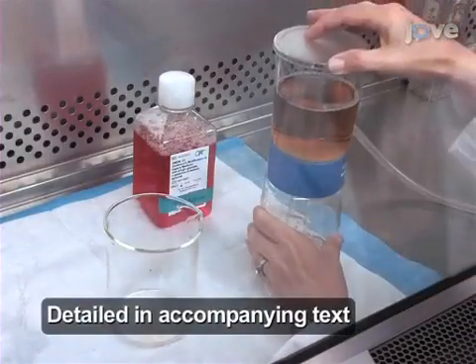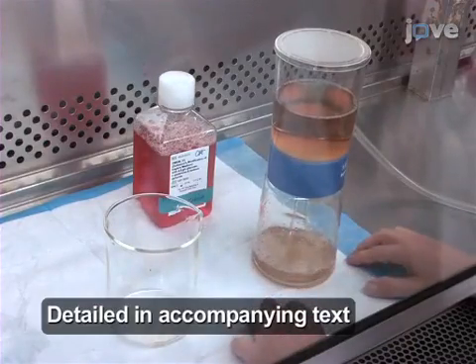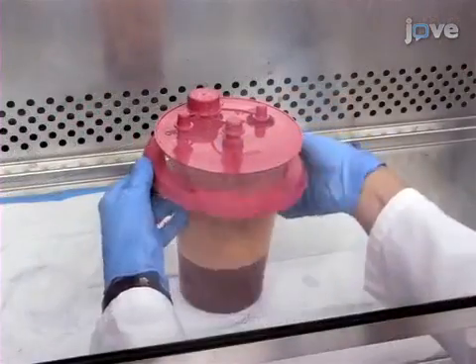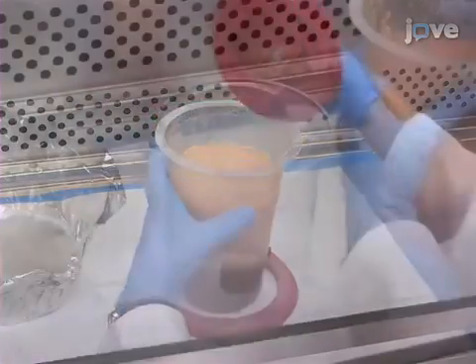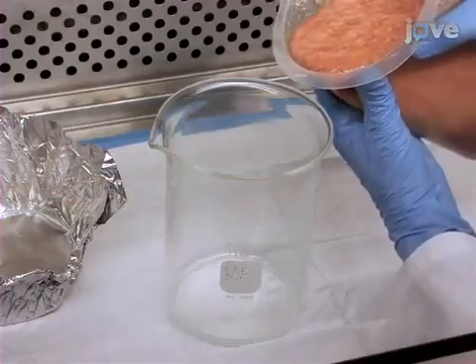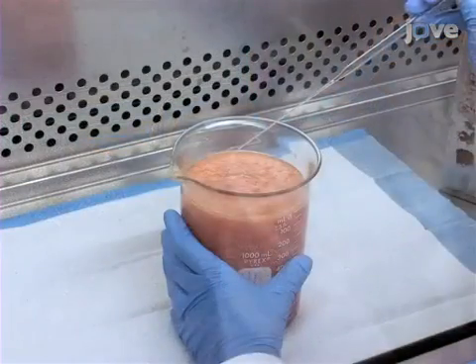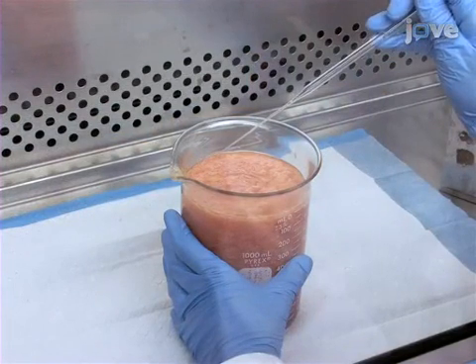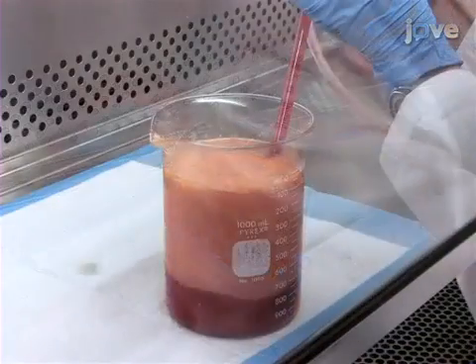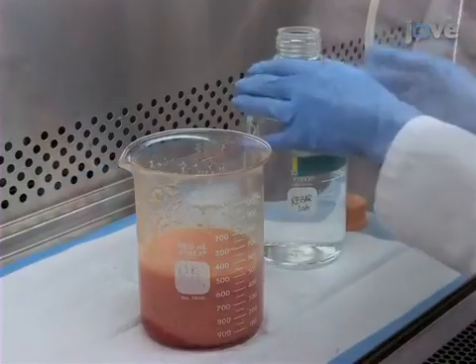Prior to the cell harvest, prepare sterile collagenase type 1A solution and sterile control medium. Collect the lipoaspirates in an aspiration container. Carefully decant the lipoaspirate into a sterile 1L glass beaker. When the lipoaspirate layers have separated by gravity, aspirate the top oil layer if present. Also remove the bottom infranatent. Assess the volume of the resulting adipose tissue layer.